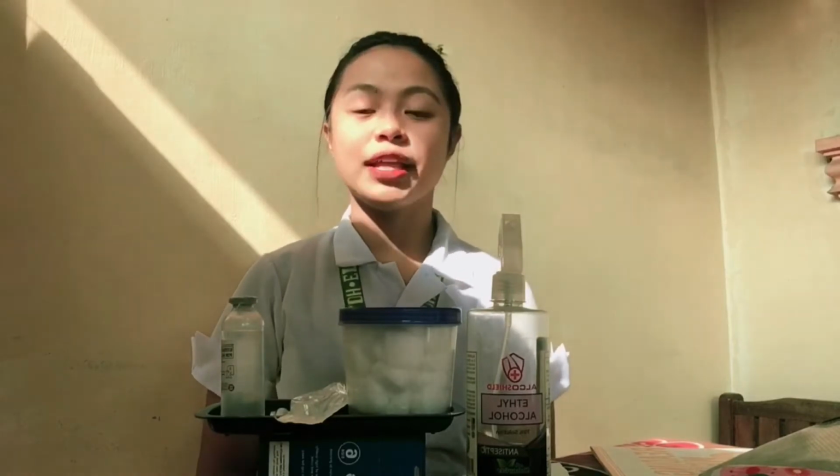So now I'm going to demonstrate to you the administering of intradermal injection for skin test. The rationale of this is for us nurses or student nurses to verify if our patient has an allergy to a specific medication.